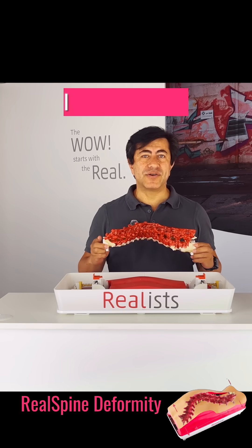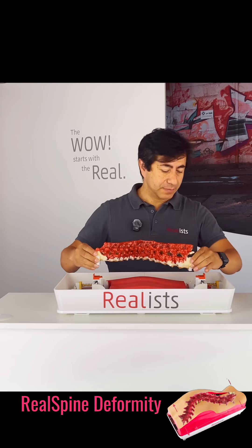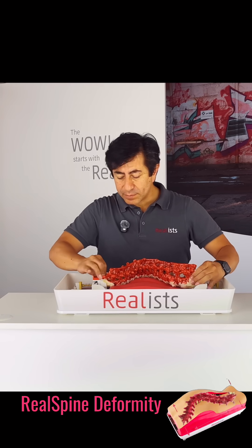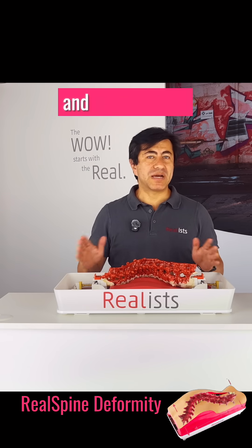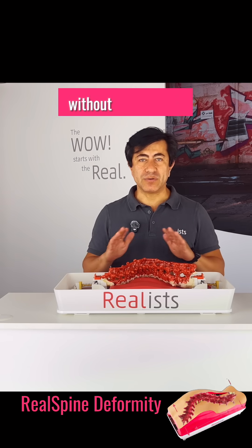In under a minute, I can replace the entire spine. Perfect for courses, multi-station setups, and back-to-back evaluations without any delay.